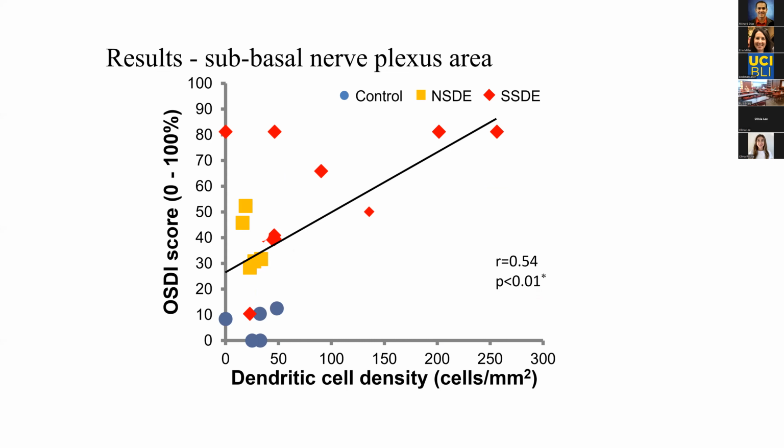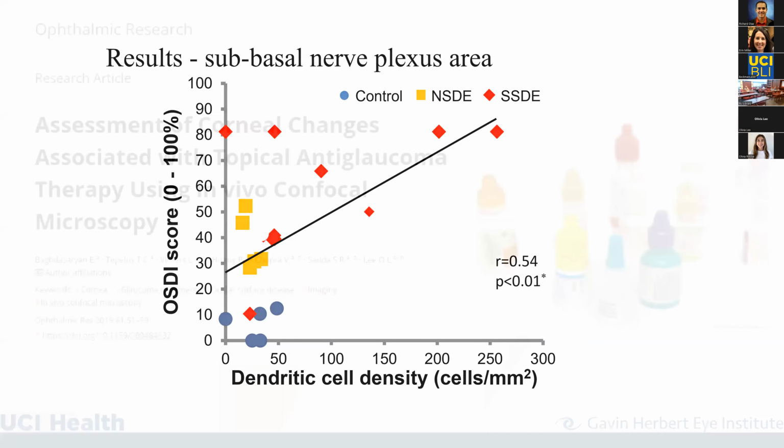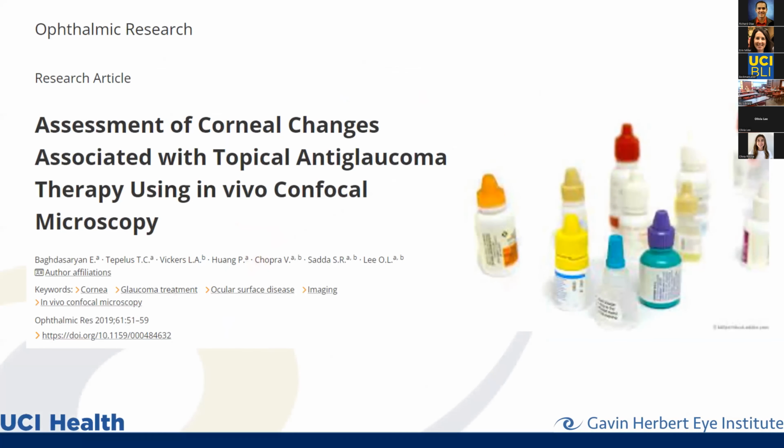So does that mean that if I use my confocal findings as clinical endpoints, try to improve those confocal findings, the patient will feel better? Will the patient get better? That is a question I'm going to come back to a little bit later. So the next thing I did is, well, what if I just pick a disease that's like, I picked this drug toxicity condition because I wanted to take something that wasn't inflammation from a systemic condition or a local condition, but an iatrogenic one.